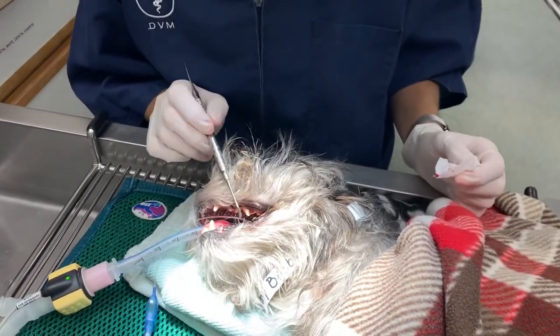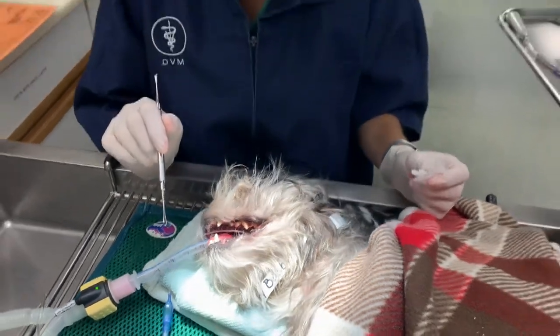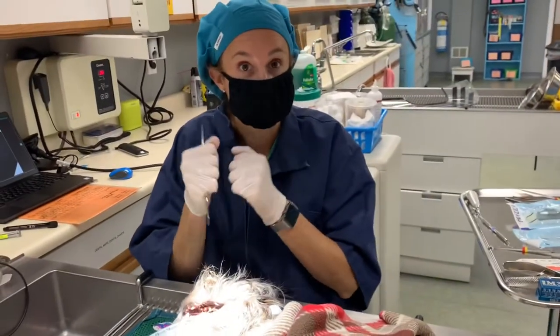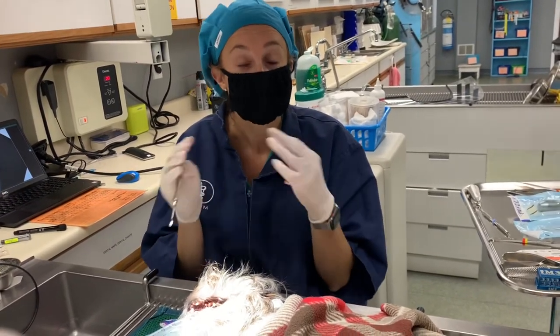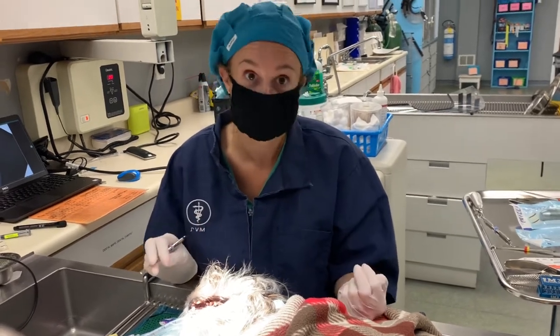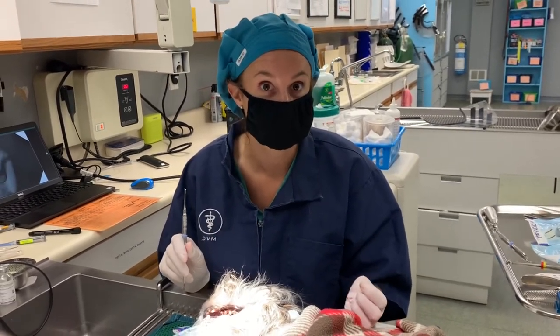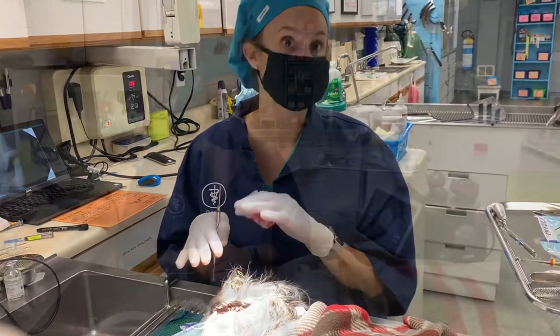We're going to pull all of these bad teeth. We're going to shave this dog's face today so we can place a tape muzzle, because we're basically going to allow this to continue to be a fibrous union. He's going to have canned food, pain medications, and antibiotics while we get this all cleaned up. He should feel a heck of a lot better once we get all of these diseased teeth out. We'll pull all this and then show you what it looks like with the tape muzzle.